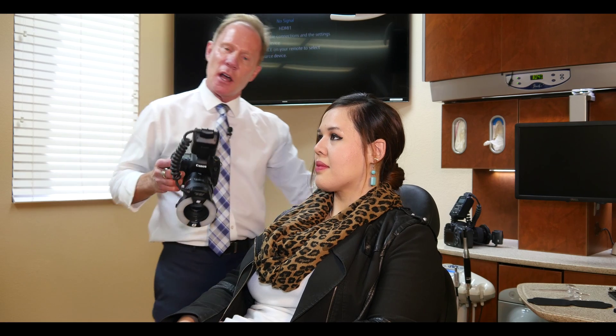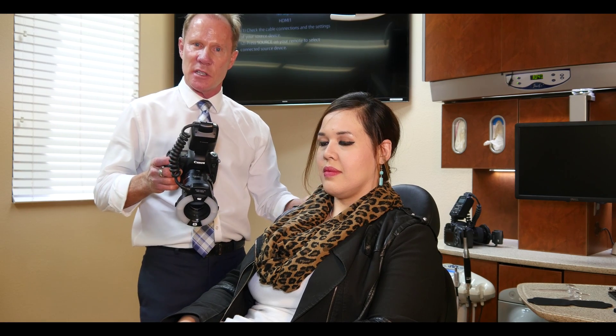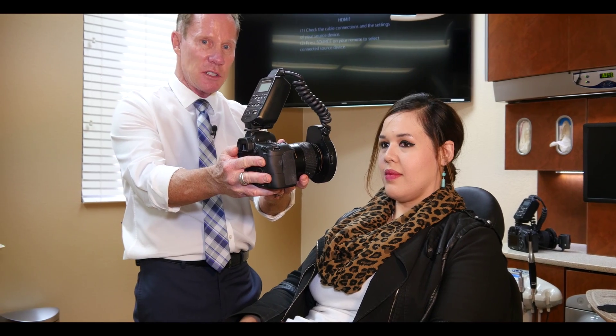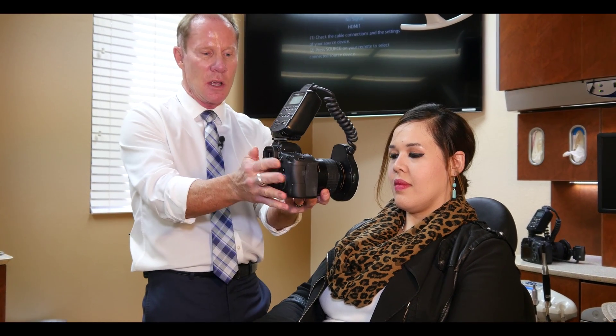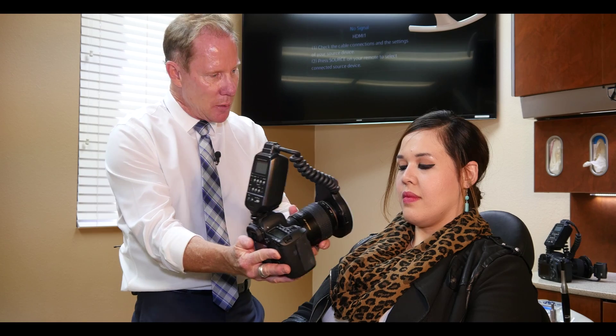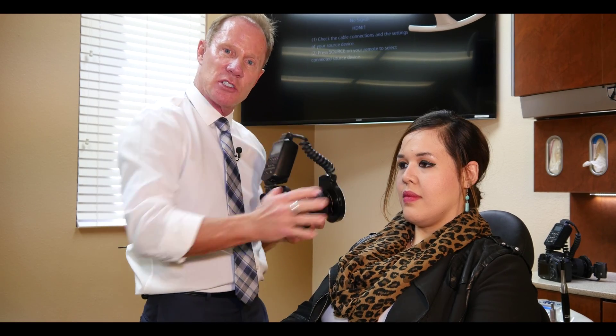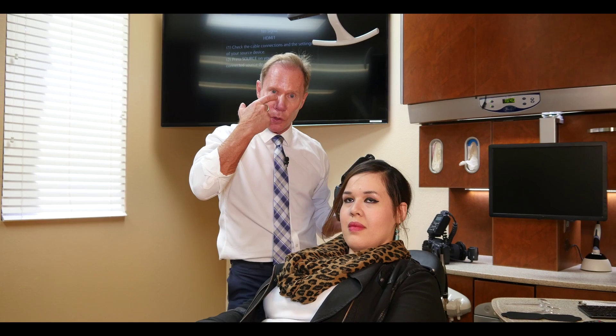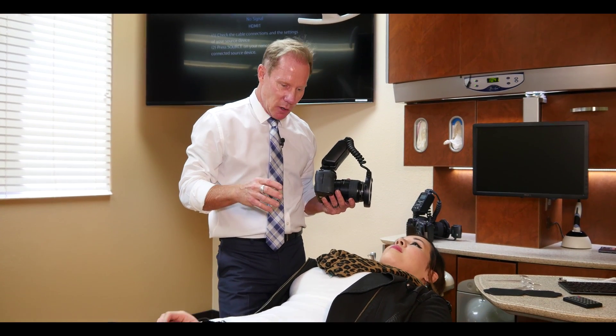A lot of dental photographers like the patient to be sitting up. The problem with this is the camera is heavy and it wants to tilt down. So if I take a picture straight on, the photographer tends to drop the heel of the camera down, making it more stable but shooting up at the arch instead of directly at it. So I prefer to actually have my patients laying down — it gives me more control of my body, my arms, and the camera itself.